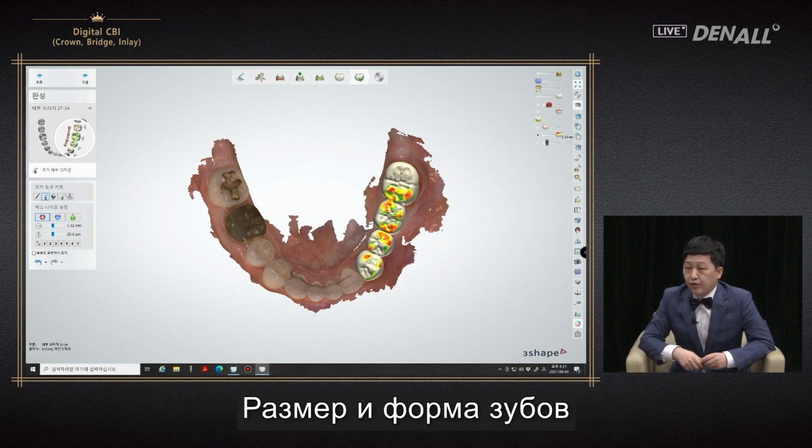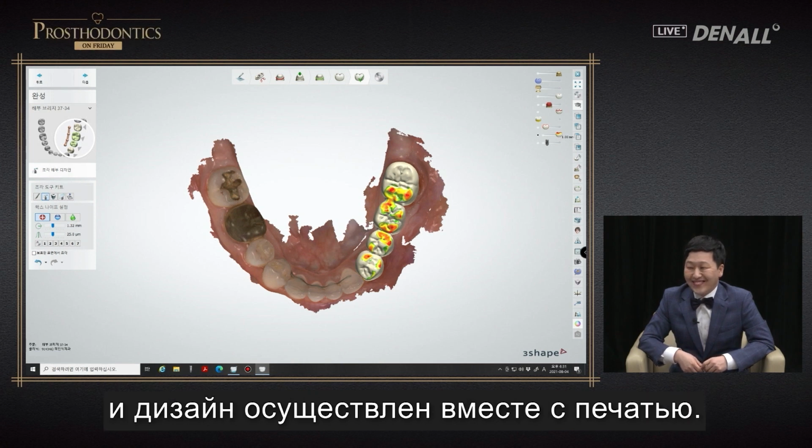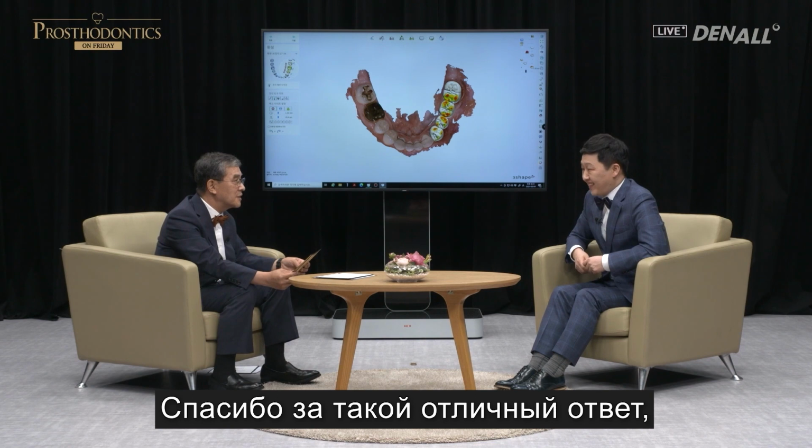The size and shape of the teeth on the other side has been considered, and design was done and printing was done.